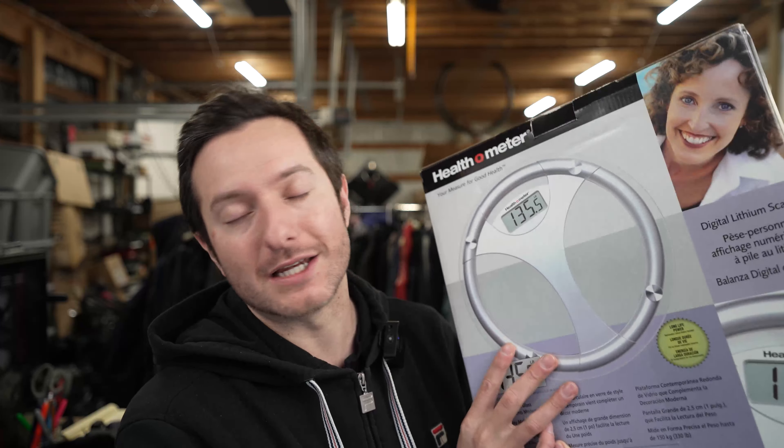Whenever we want to weigh ourselves — usually once a week — it is a really accurate scale that runs on digital lithium batteries. It's much more accurate compared to a manual analog scale. We've tested it against other scales and it holds up. We've had this for a few years and it has yet to break down. Love it, would highly recommend it.